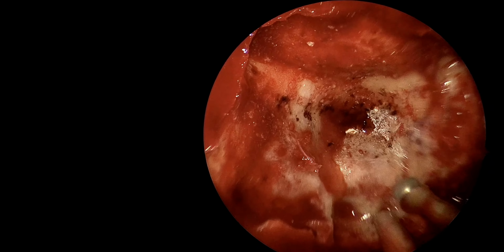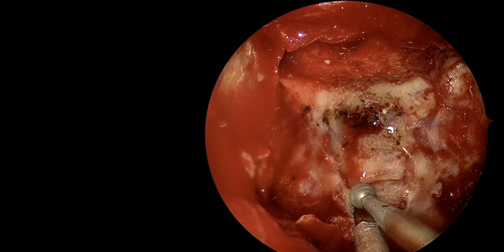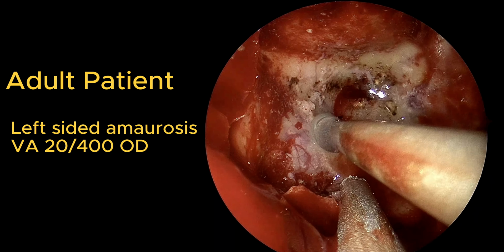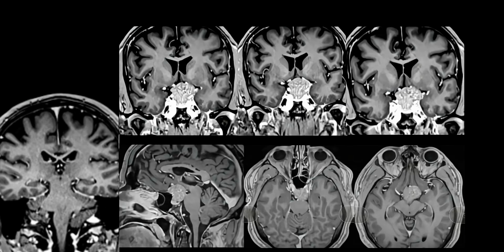Today I will show the surgical tenets of a complex tuberculum sellae meningioma resected through an endoscopic endonasal approach. This patient presented with progressive bilateral vision loss. Visual acuity was 20/400 in the right eye with complete amaurosis on the left.